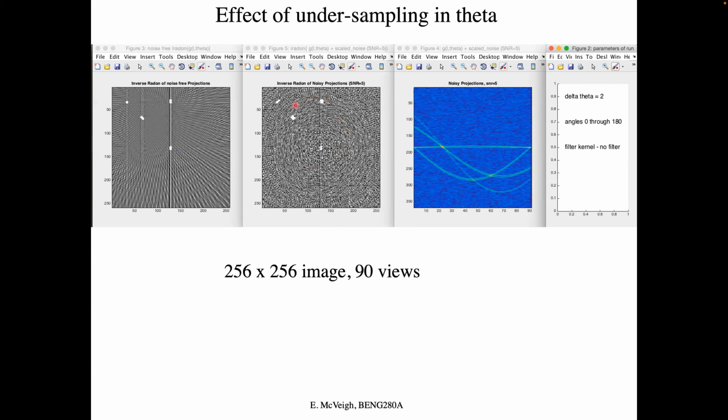And we look at the background noise, and this background noise in the periphery also obviously has some interesting structure to it. Whereas the noise right at the center looks like it could be just a random blob. So there's some kind of spatial change in how the noise field looks when you increase the number of views.